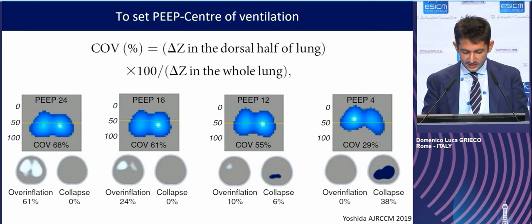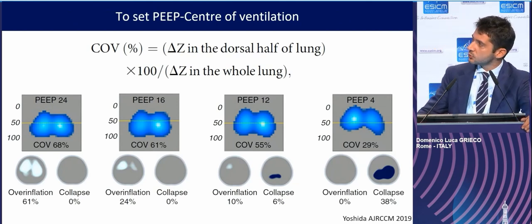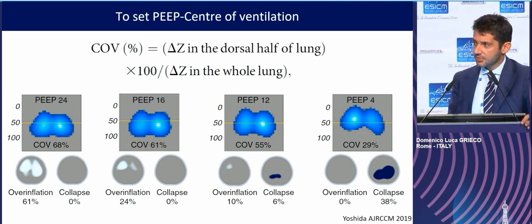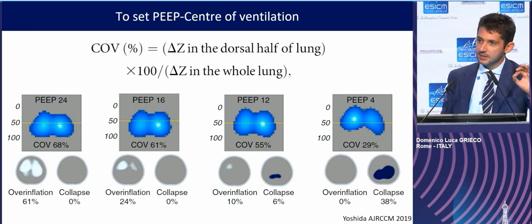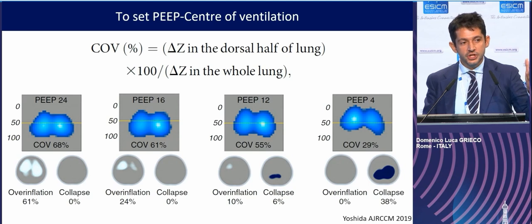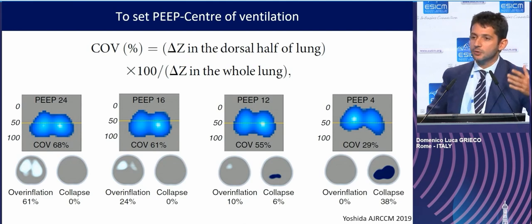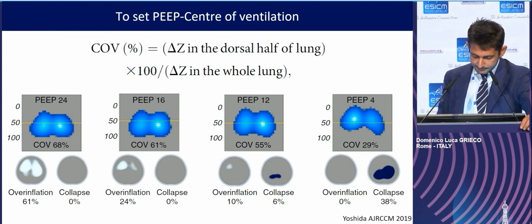during pressure support ventilation. However, this way to set PEEP and to balance between hyperdistension and collapse starts from the assumption that the best PEEP for the individual pixel is the one corresponding to the best compliance of that pixel, which is obviously something physiologically reasonable, but still an assumption. And there are other ways to see the problem in terms of mechanics.